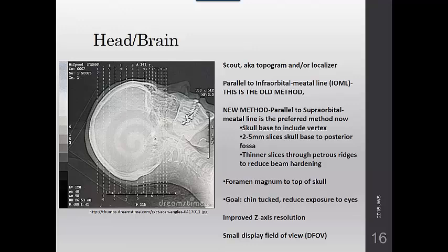Hey guys, this is still lesson 1 in CT 4071. We are going to start talking about imaging the non-contrast CT head brain. In today's lessons, we're going to be discussing positioning, imaging, and anatomy of the non-contrast CT head.